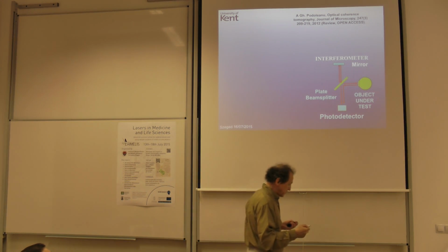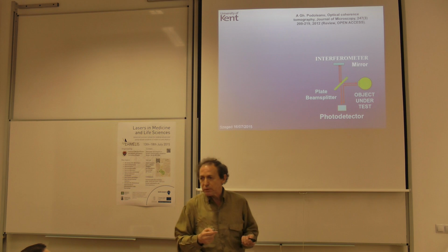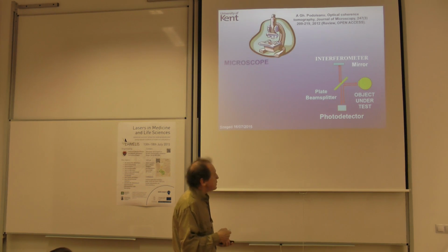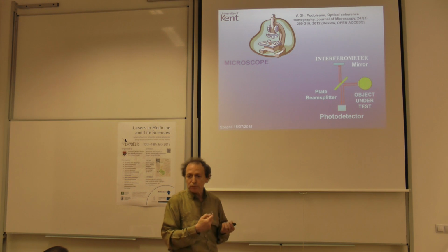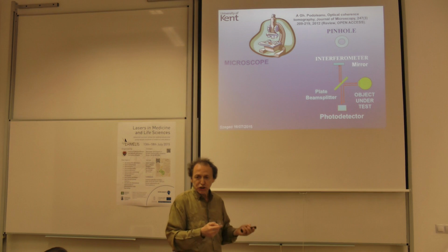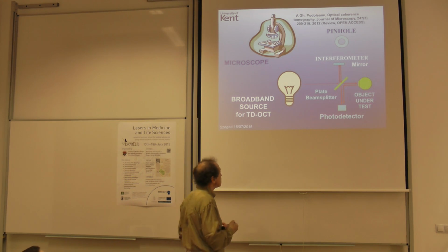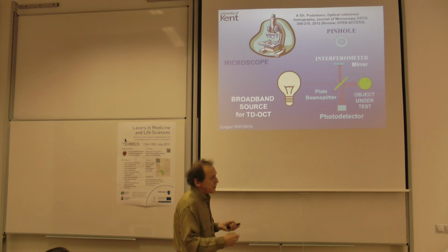So far we discussed interferometry principles, low coherence interferometry, adding scanning on top of that, producing an optical coherence tomograph. Now let's dwell more on the technology of OCT. So what do we need to build a tomograph? You need this interferometer, I already alluded. To get a good image, you also need interface optics, and for the eye we use a chin rest, or for microscopy we use a specialized confocal microscope. And you need here to add a pinhole to reject the off-axis rays, and the broadband source. So that was what I have explained so far. That was the principle of time domain, and the larger the band is, the better the axial resolution.